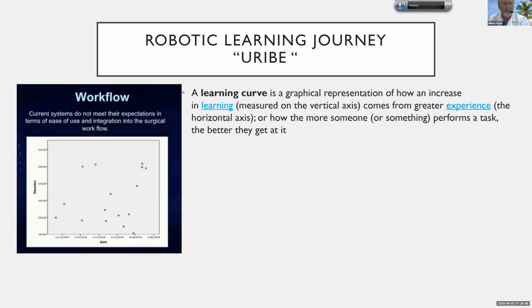And this workflow is from Juan Uribe's talk, in which he shows the plot on the left, which essentially shows that there's almost no learning curve with the robot that he's using. If you listen to his talk, which I've heard a couple times, I know Louise and I heard it in New York, and I've seen it on ViewMedi.